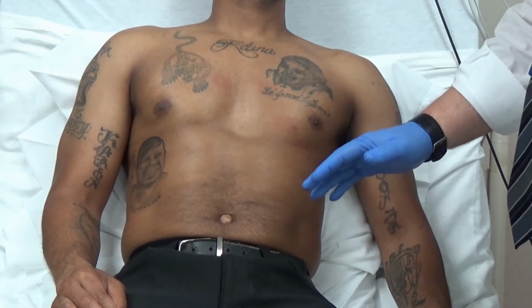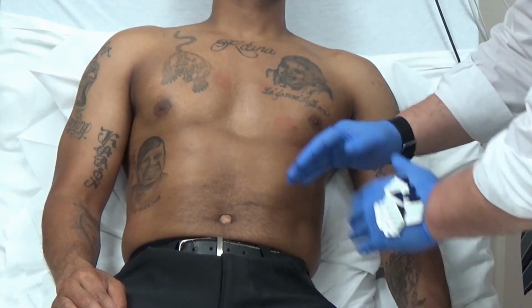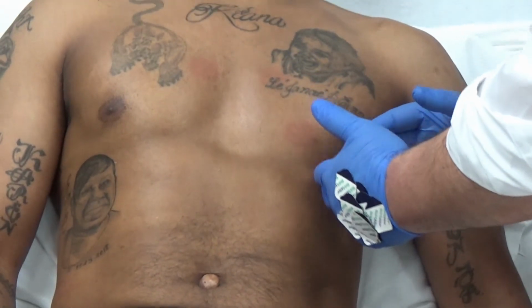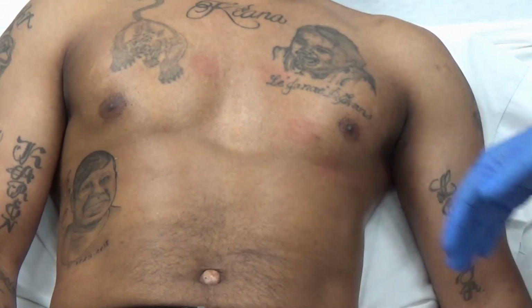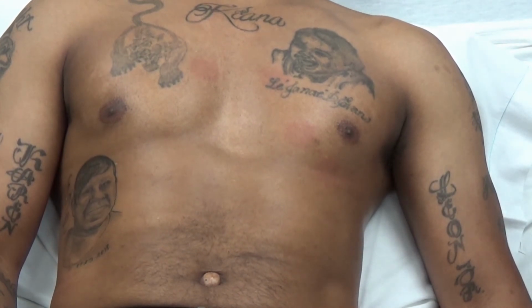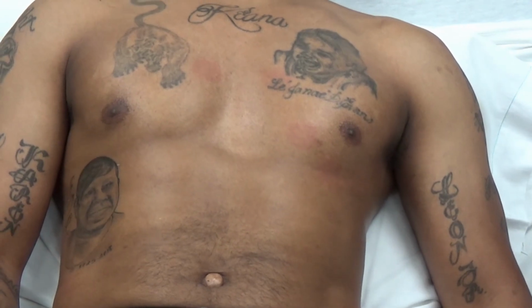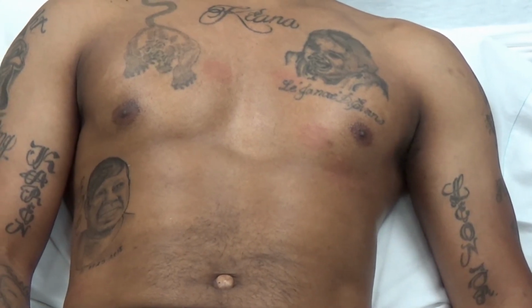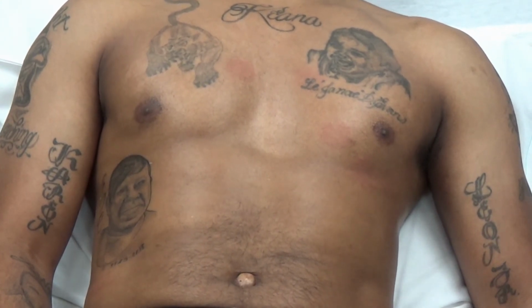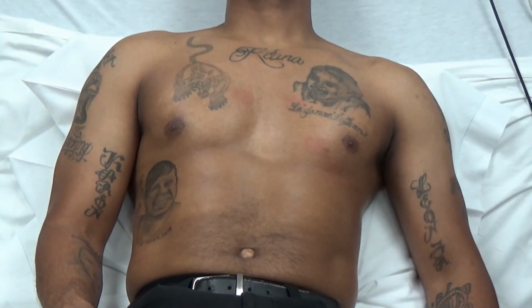If you ever do have a woman who has a lot of adipose tissue in this area, you would just use the back of your hand, let them know, ma'am, I'm going to have to lift your breast up to adhere some stickers for this EKG. If you feel uncomfortable, always ask someone to come in with you. You could ask another respiratory therapist, preferably maybe even a female respiratory therapist, to come in and do the EKG for you, in exchange for helping her out with something she may need later. That is another option.